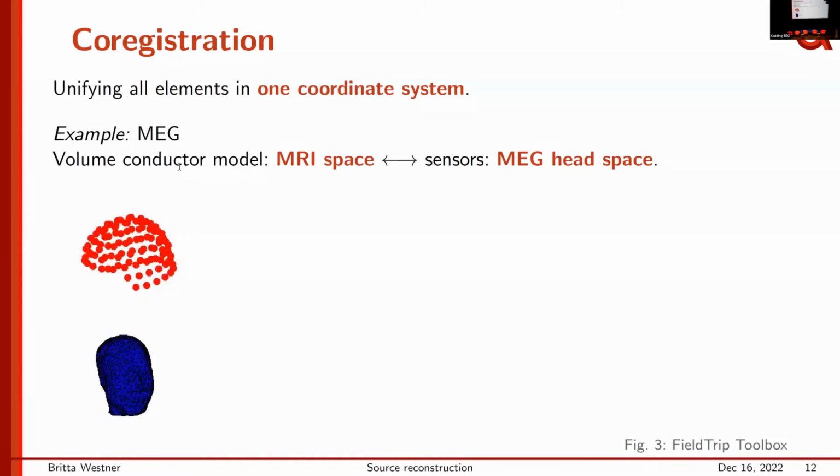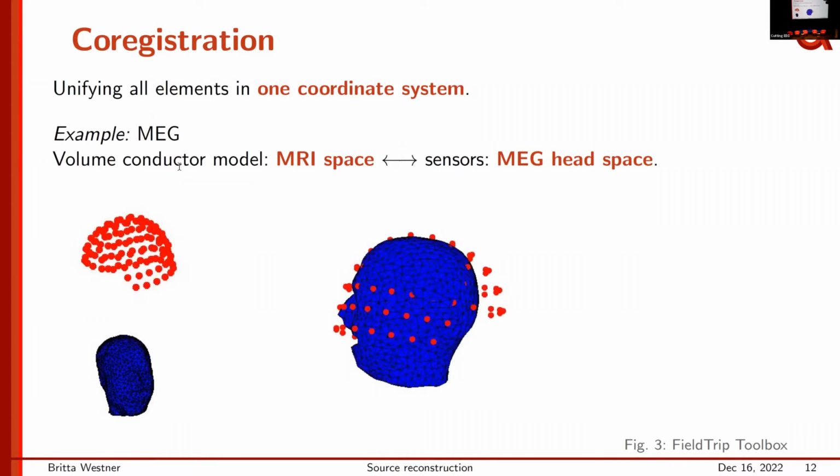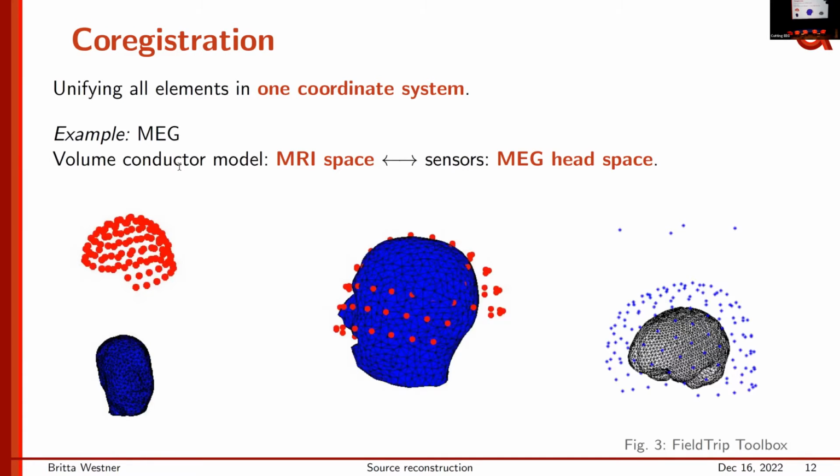So I hope this is not how the MEG people in the room put their participants in the MEG. You wouldn't see much. I hope this isn't how you do it either. This is a failed co-registration attempt. What I hope is that it looks something like this. Here we have just the brain. The head was inside the helmet. This was how it was when the data was recorded. So we want to get back to this for our modeling of the sources.